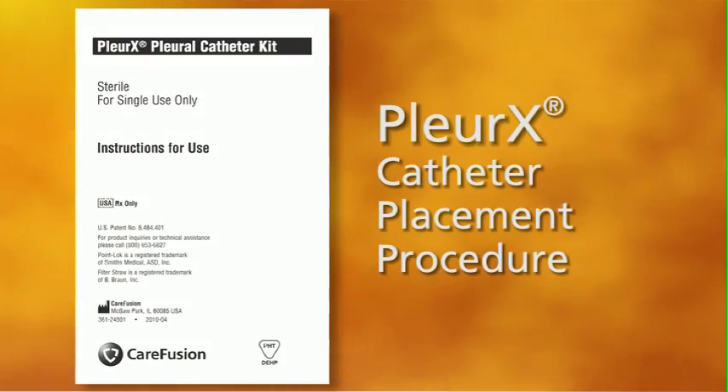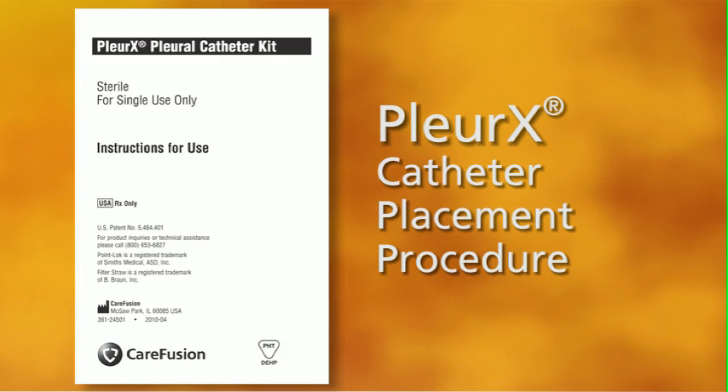The following is a suggested placement procedure. For more detail, including cautions and warnings associated with this procedure, see the instructions for use provided with the Pleurex Pleural Catheter.